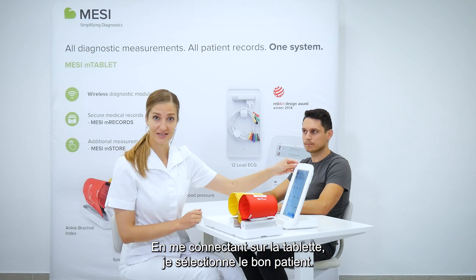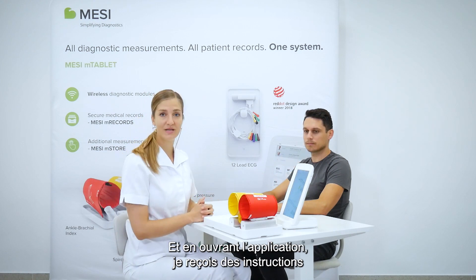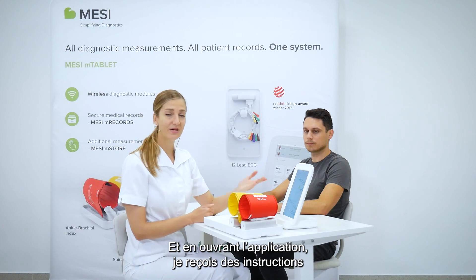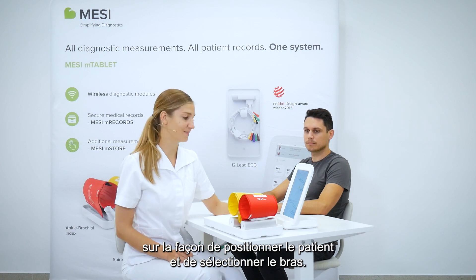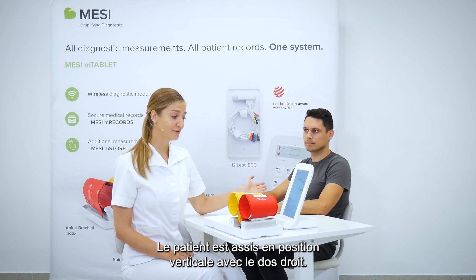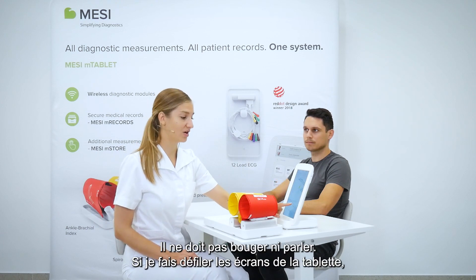Upon entering the tablet, selecting the correct patient and opening the application, we get very clear instructions on how the patient should be positioned and how to select the appropriate arm. The patient should sit comfortably upright with a straight back; he shouldn't be moving and he shouldn't be talking.